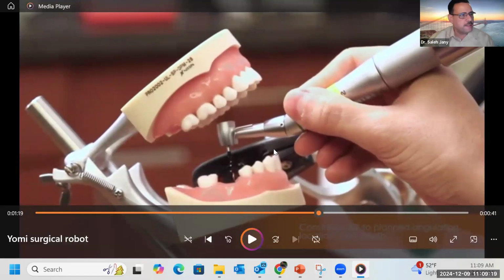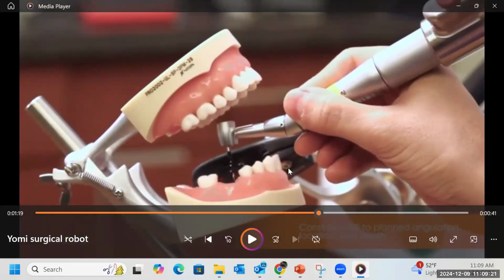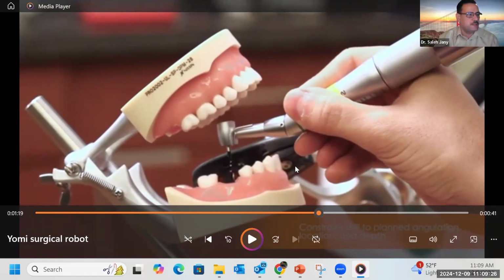Can you see the black thing? That's when we take an impression, usually either digital or regular impression, and upload it to the AI machine. The AI machine has that black thing set up on the teeth, so the AI will know where the patient is going to sit. So that's like an impression coping for the teeth. So the AI will know the patient's location in the 3D space, and then the other arm will guide the surgery.